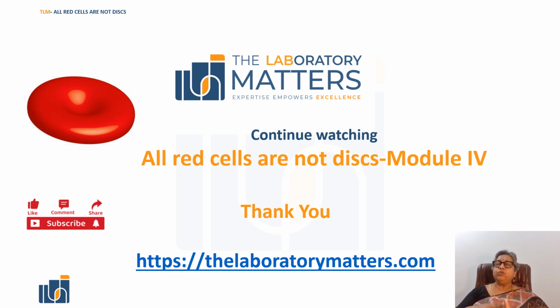And if you did, you can continue watching for our final episode on how to look for the presence of poikilocytes. Are there pointers in our CBC report, in our scatter plots, in our histograms? So that will bring us full circle, and we'll be able to start looking at all the pictures that are generated from the cell counter to diagnose poikilocytes.